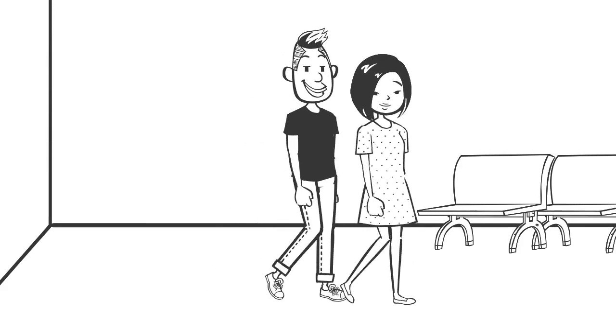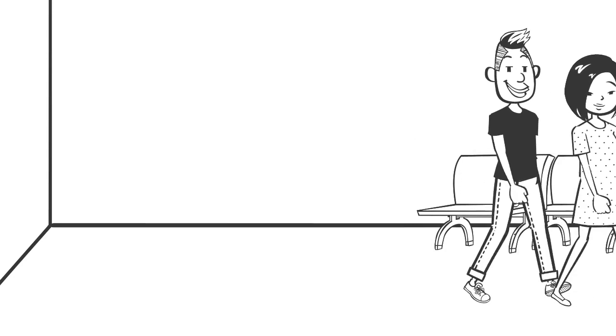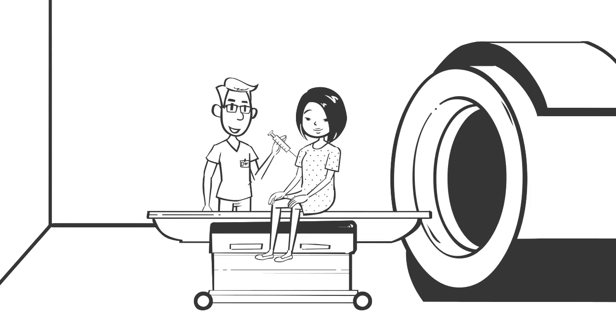Most MRI scans will not require any preparation, and after filling in your questionnaire and removing any metal items, your scan will be able to go ahead. However, for some exams, you may be required to have a contrast agent administered through injection, gas, or ingestion before the scanning begins. Contrast agents help certain areas of the body appear clearer on the images.